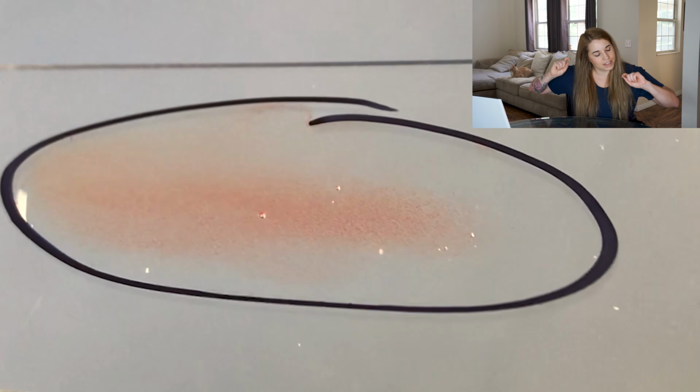If you cannot, slide on over to your microscope, throw that bad boy under there, and evaluate for microscopic agglutination. Be sure you know the difference between agglutination and rouleau for this step. Agglutination looks like red blood cell clusters. If there's agglutination, do not give your transfusion. Start over and try again. Do not pass go, do not collect $200. Which means you have another hour of doing a cross match with either a different packed red blood cell or a different donor. But if no hemolysis, no macroscopic agglutination, you can proceed with your transfusion.